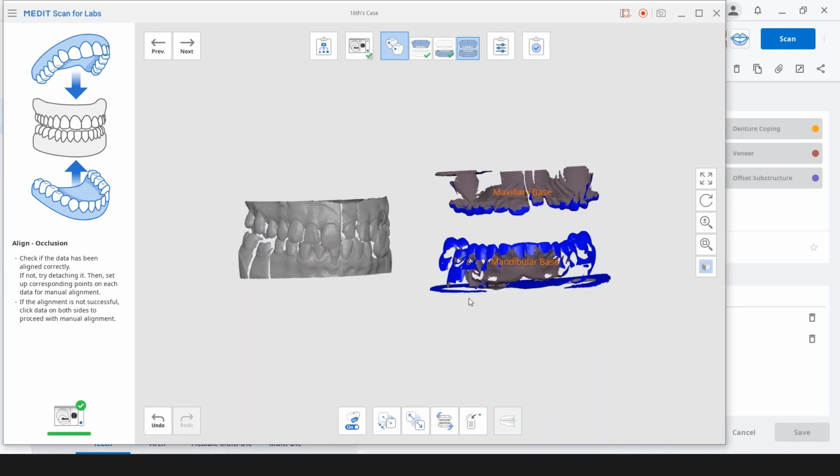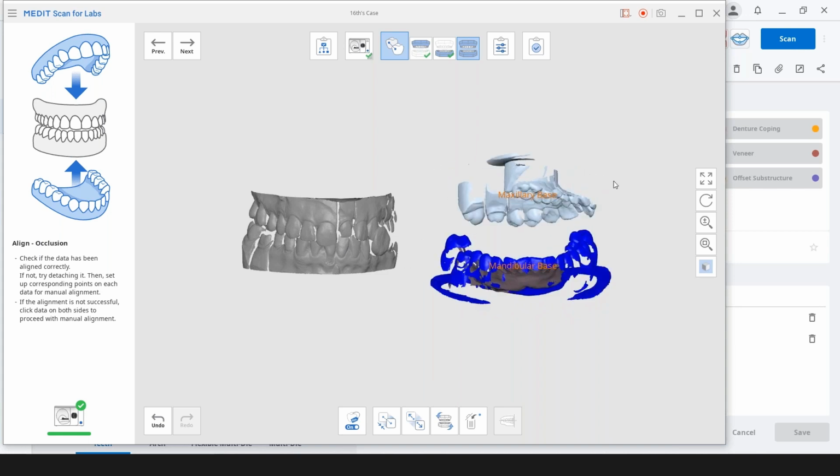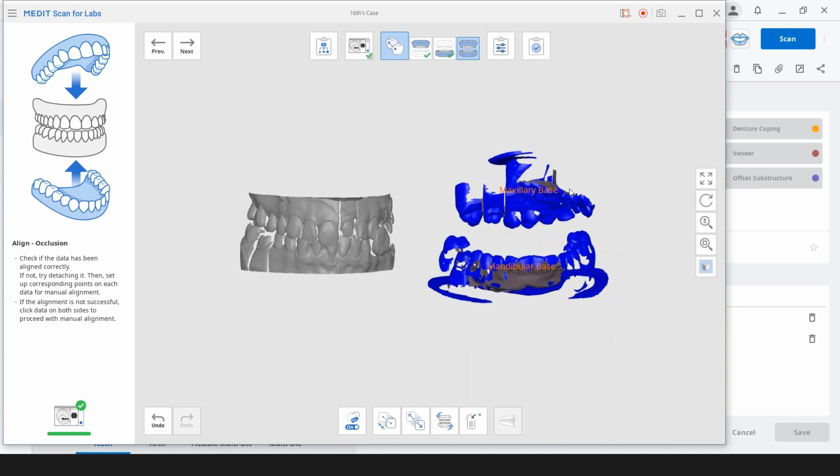So you do have the option to pull it apart. You can do point matching. If I could see this, something must have gotten in the way when I trimmed it wrong. But normally this will look just like that, and they'll just float into each other. I don't know why that came out like that, to tell you the truth. I did something wrong.